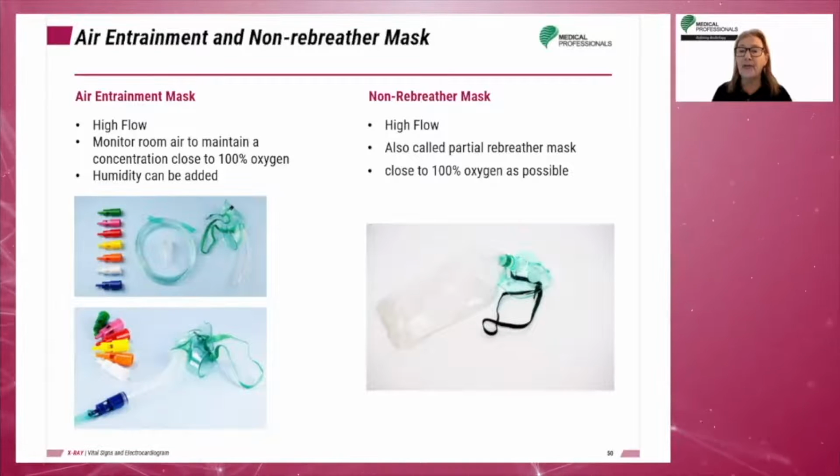The air entrainment masks are not well tolerated by patients. They are hot, stick to the skin, muffle speech, and must be removed for eating.